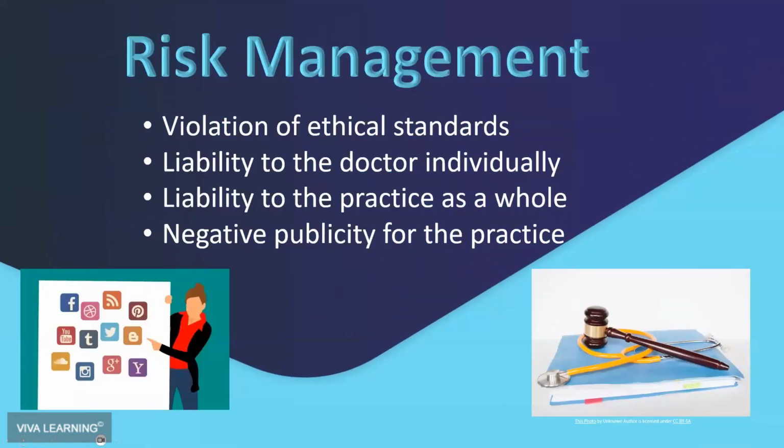The other issue that we need to look at, and really what a lot of this information is related to, is risk management. If you are not ensuring that your sterilizers are working appropriately, and not just, again, at that weekly spore test time, but that every pack that you put in the sterilizer in every single load has been exposed to all the parameters needed for sterilization.